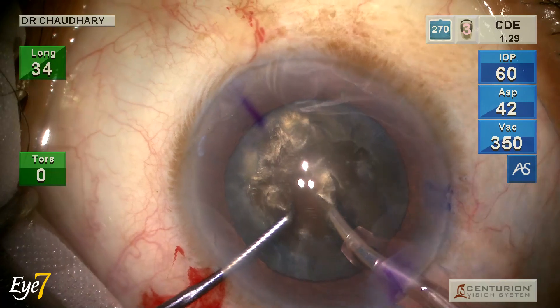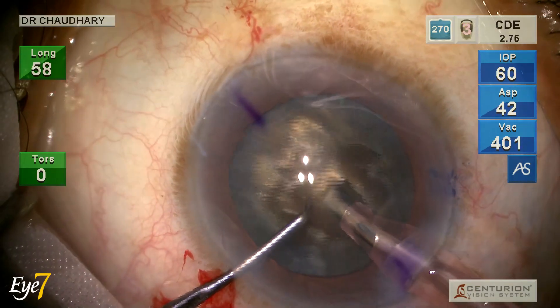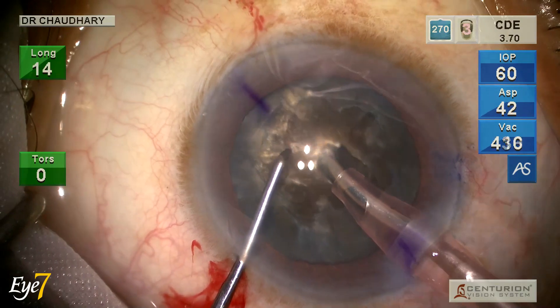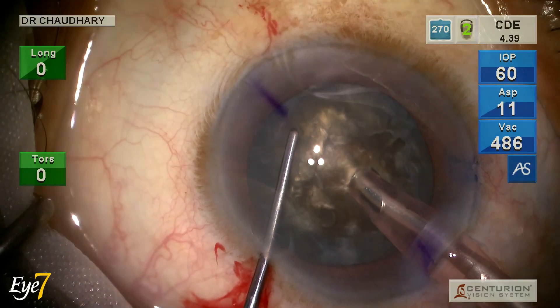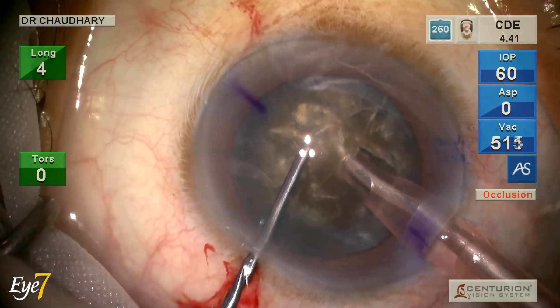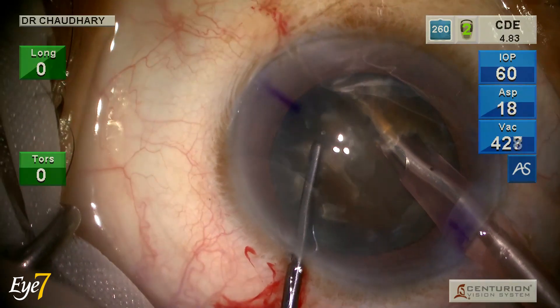I start with our special maneuver: making a small groove extending from the mid-periphery to the center, so that in the center I can bury my phaco tip in the substance of the nucleus. The long chopper is at the edge of the capsulorrhexis and goes deep into the substance of the nucleus.